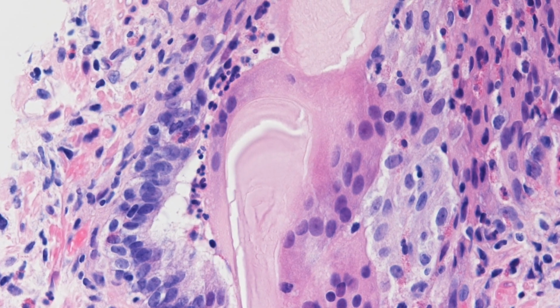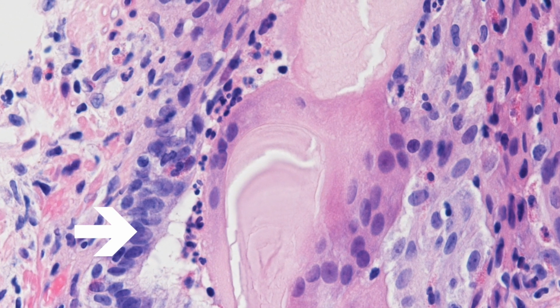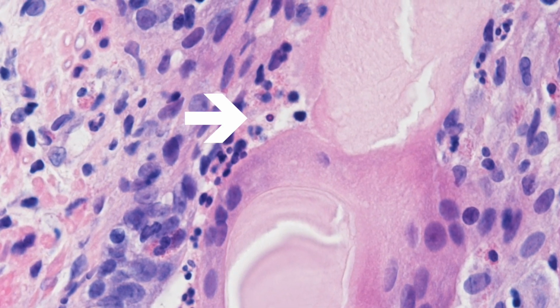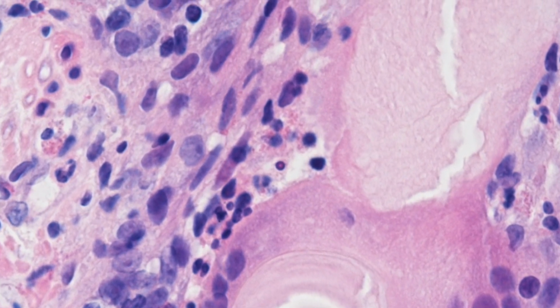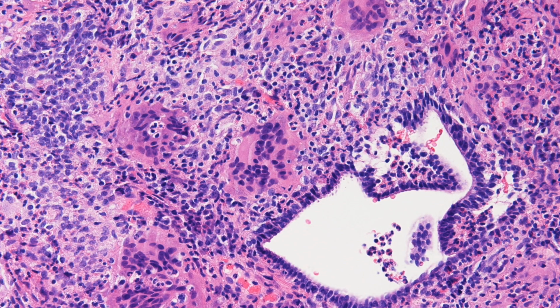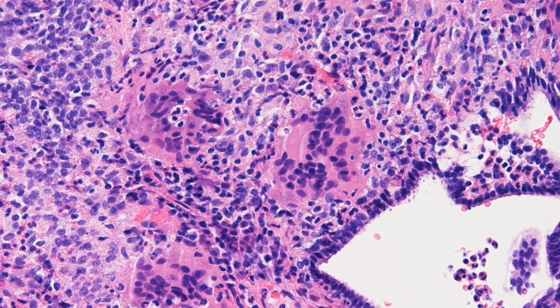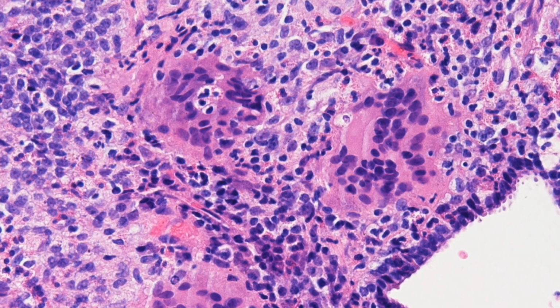And here is a higher power view of a duct showing intact epithelial cells at the bottom left of the picture, and as we move towards the top of the duct, the epithelial cells have been destroyed by acute inflammatory cells. And around this duct is a mixture of acute and chronic inflammatory cells together with multinucleate foreign body type giant cells.